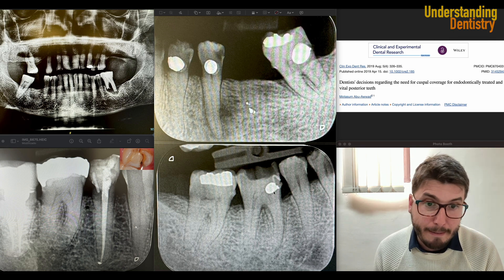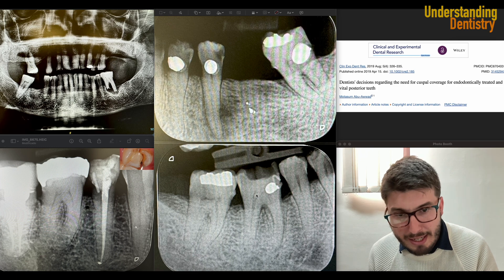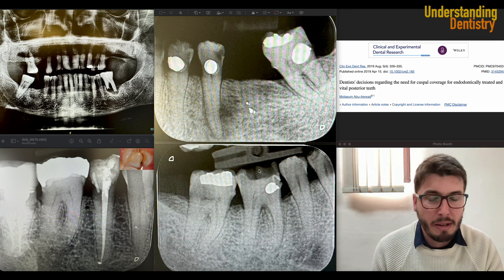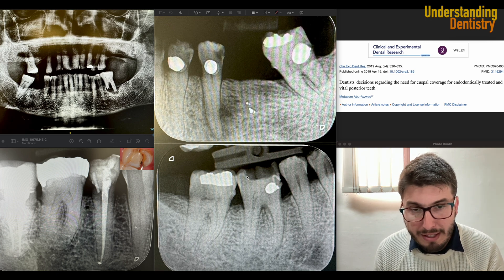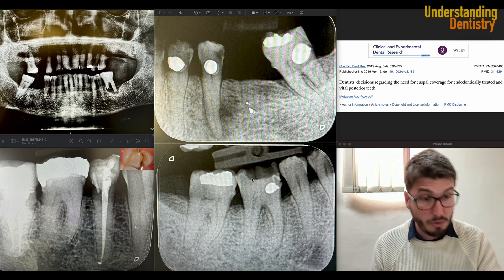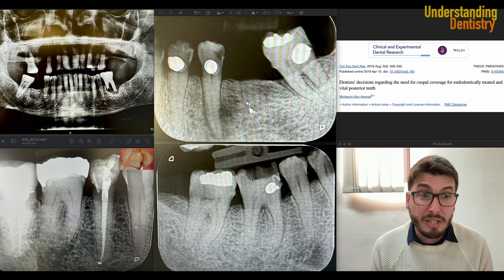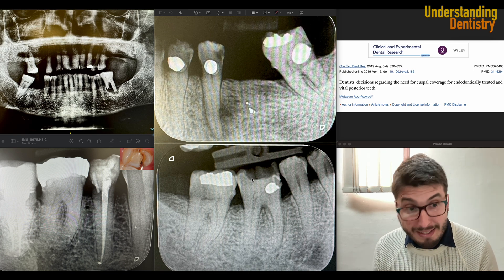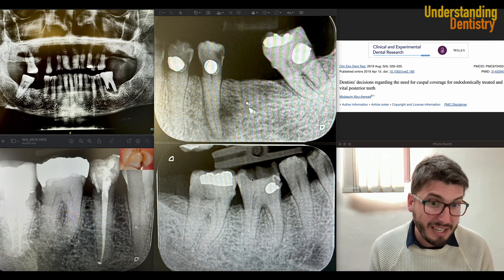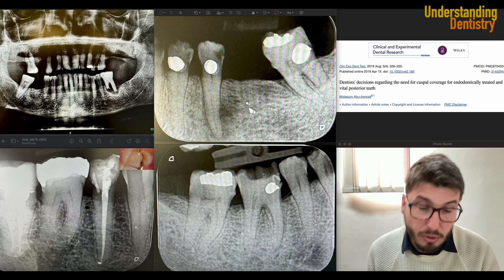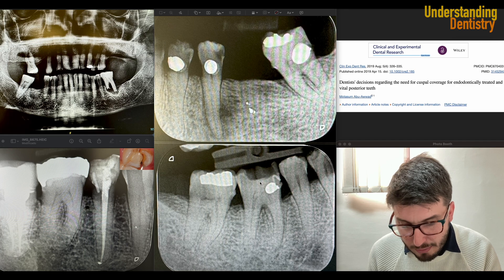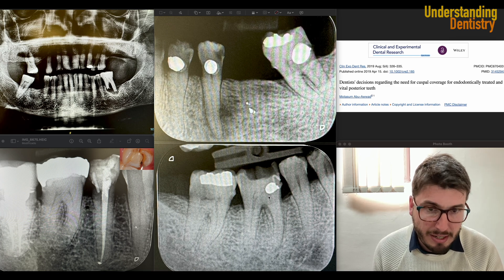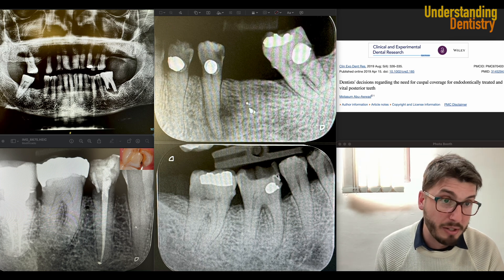There is also the first molar with a buccal restoration and pulp chamber atrophy, but there is a fracture of the occlusal surface. Since the fracture involved the palatal cusps, we now need cusp coverage. If you don't have the palatal cusp anymore and it's just a MOD restoration, maybe you could do the restoration only — but if there is a fracture of a palatal cusp, most likely you will do a preparation and a crown. You need to correlate with the clinical diagnosis, and most likely root canal treatment should be considered given the pulp chamber alterations.